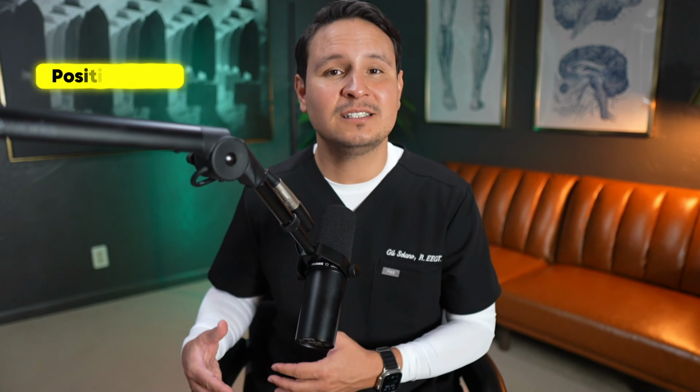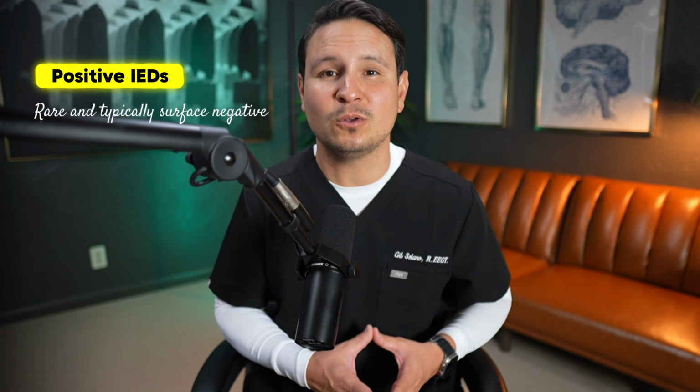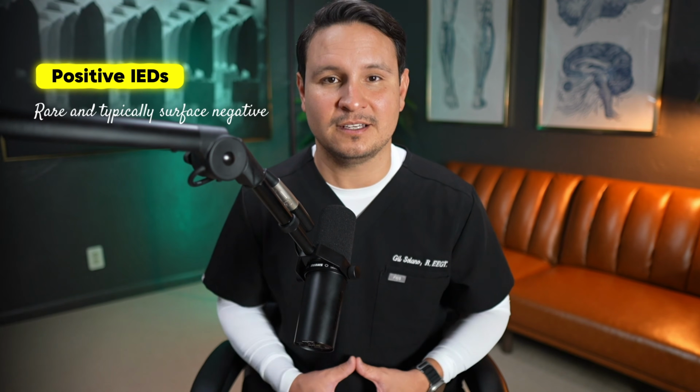Okay, that's a lot of information, so let's break it down in an easy to understand recap. Let's start with positive interictal epileptiform discharges. They are rare in routine clinical EEGs, typically surface negative.